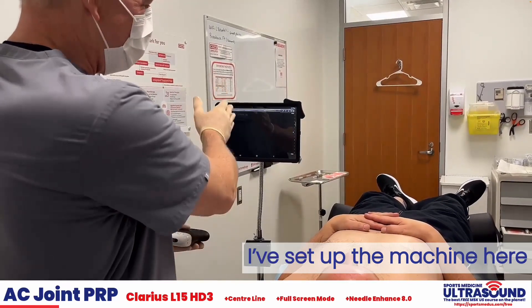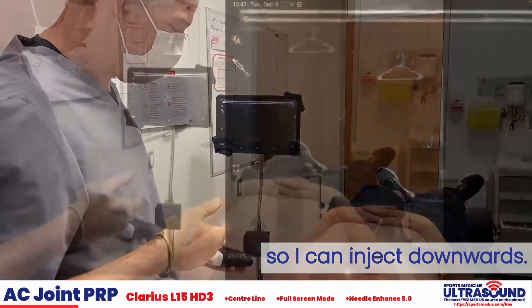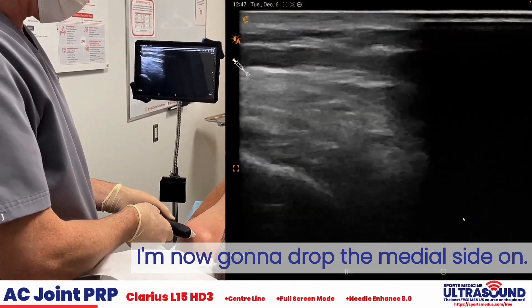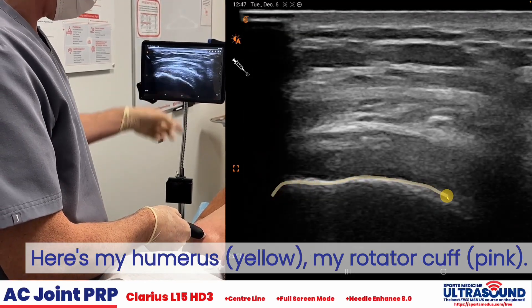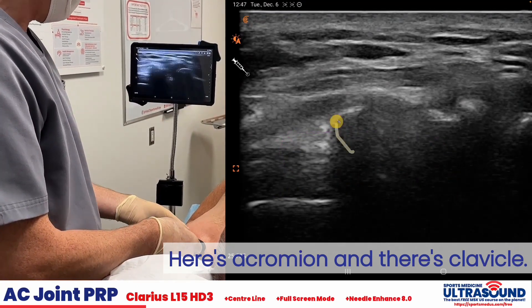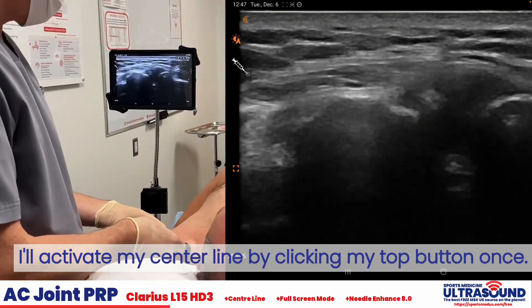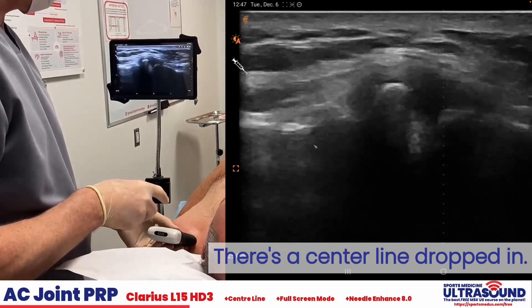First thing I've done is set up the machine here on a right-handed injector, so I like to inject downwards. Left side of the screen is going to be lateral. I'm now going to drop the medial side on. Here's my humerus, my rotator cuff. I'm going to slide medially until I can find the acromion. Here's the acromion and there's the clavicle. I'll roughly center it and activate my center line by clicking my top button once. There's the center line dropped in.